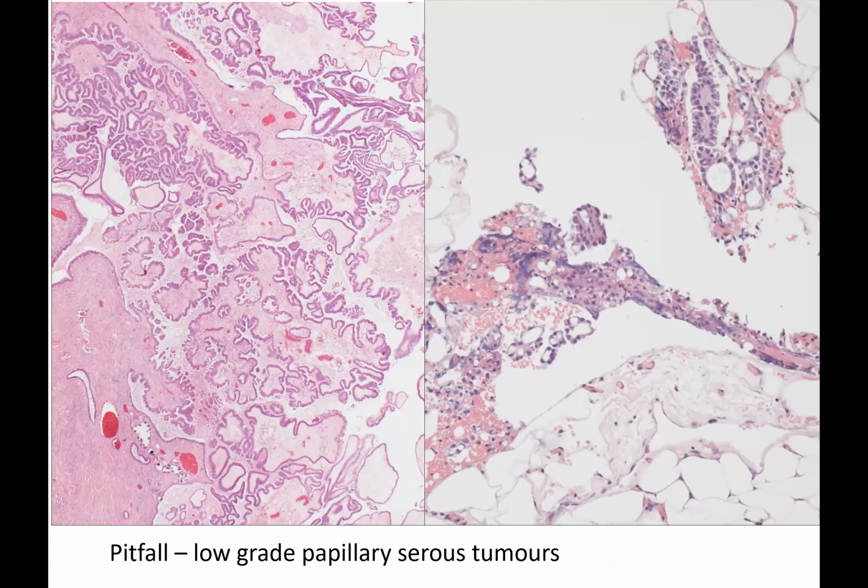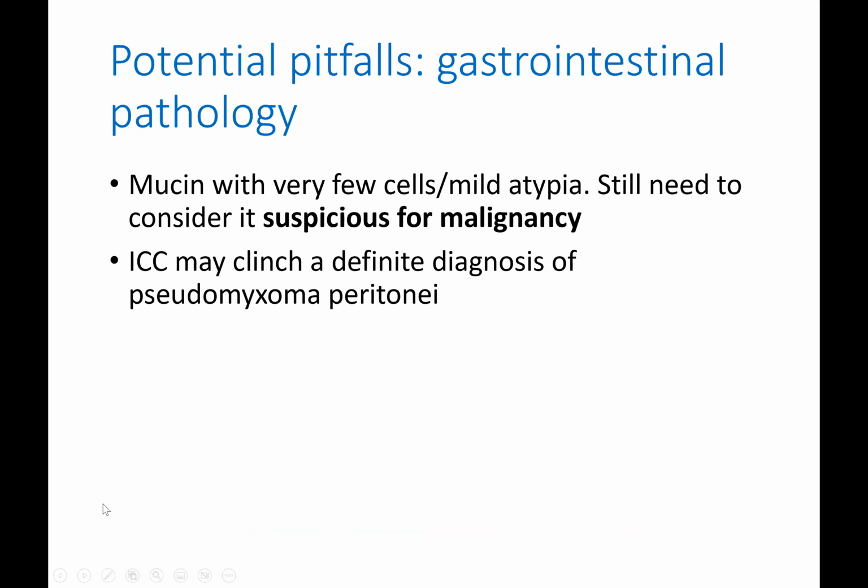And we can see that in correlation with histology, there were bilateral ovarian serous tumours with micropapillary type with an exophytic surface component, and that probably explains why there was very florid cytology. The omentum contained non-invasive desmoplastic implant.